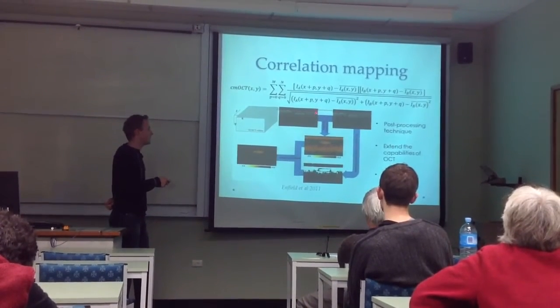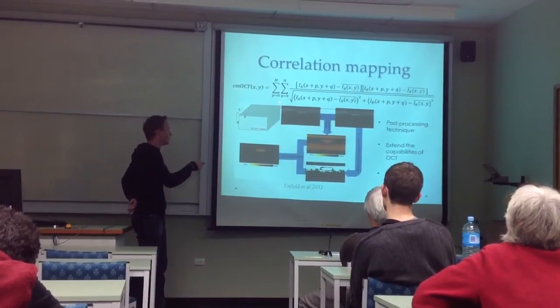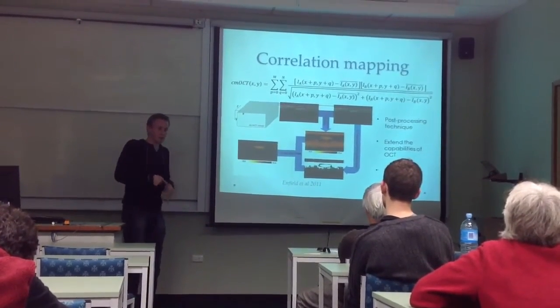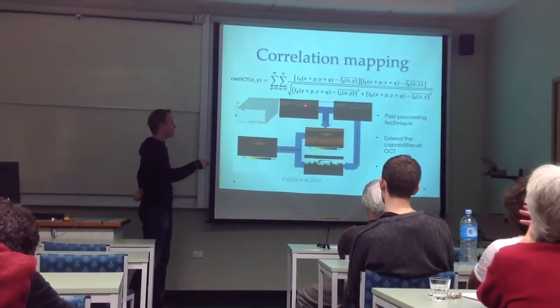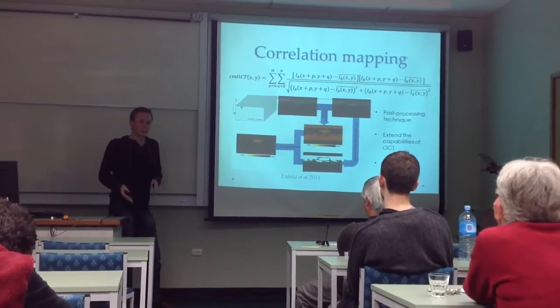Where you've got static tissue, the image is essentially going to be the same. So you might move a slight distance, and there'll be a slight time difference. So the fluid inside the blood vessel will move, as this is skin, but the skin will essentially stay in the same place.